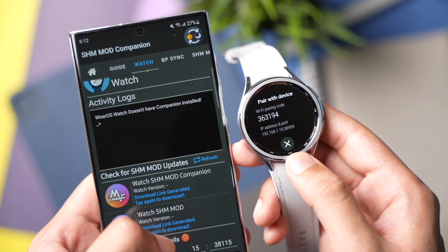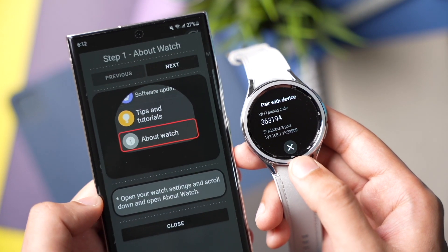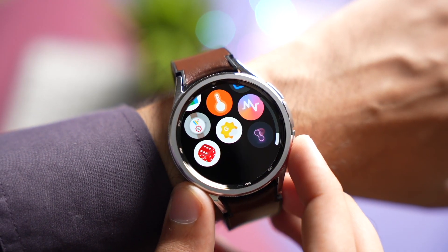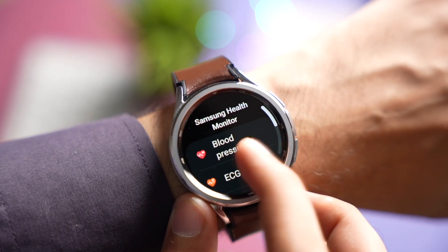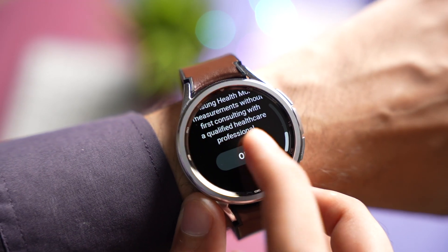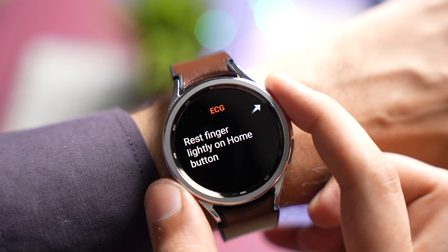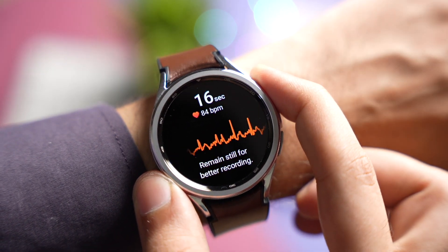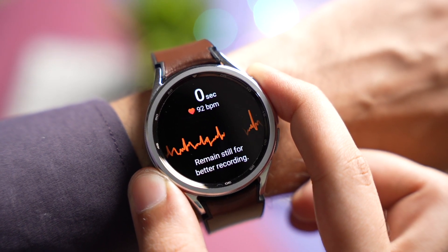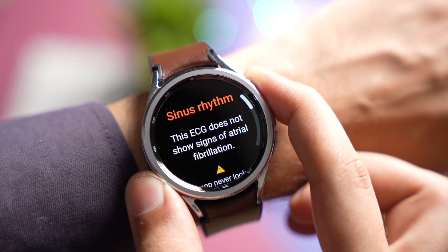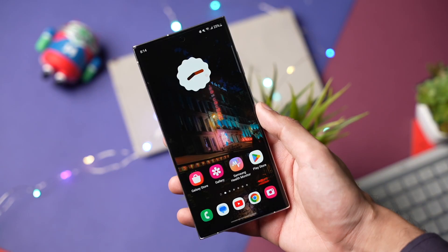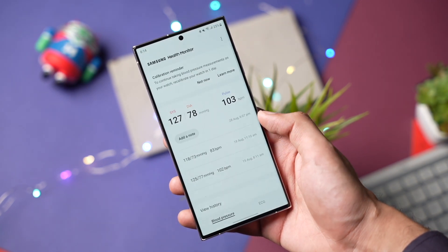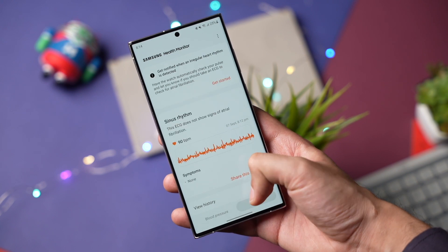Once you have updated these apps on your phone and watch, you have to take an ECG. Once the ECG is completed on your watch, open the phone Samsung Health Monitor app.